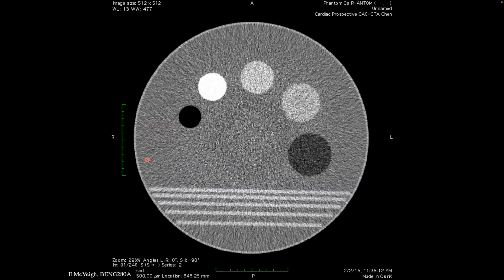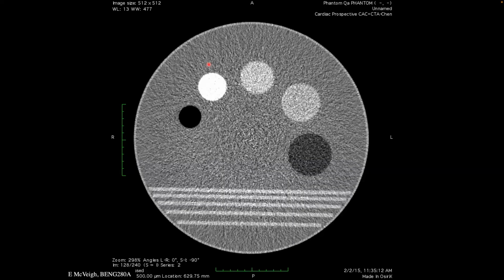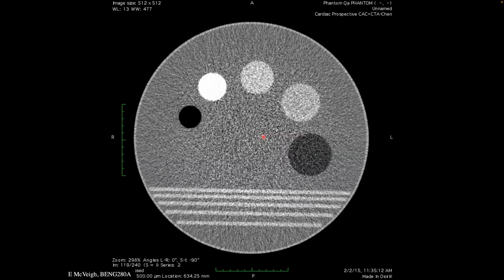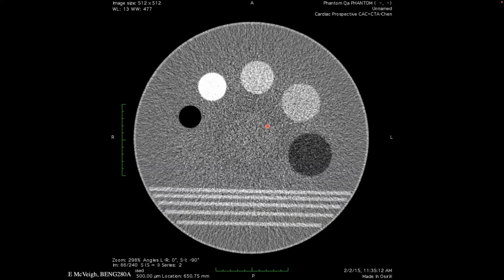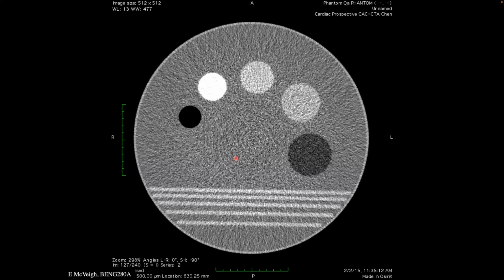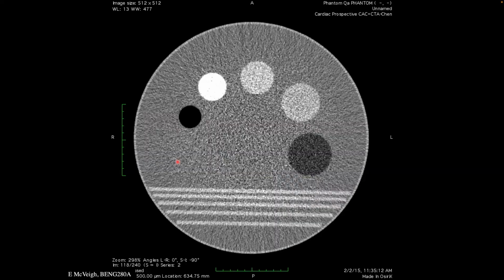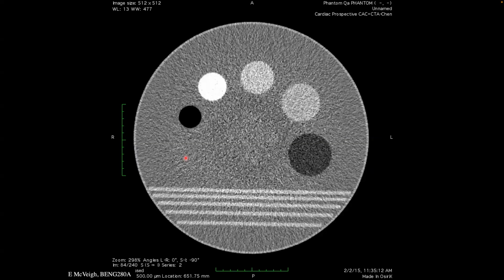And so in CT, to fully characterize the system, you want to make those measurements as a function of position in the field of view. You can see that on occasion there are some correlated circular structures in there that you'd never see in MR, for example. And in MR, you very rarely see these streaks.